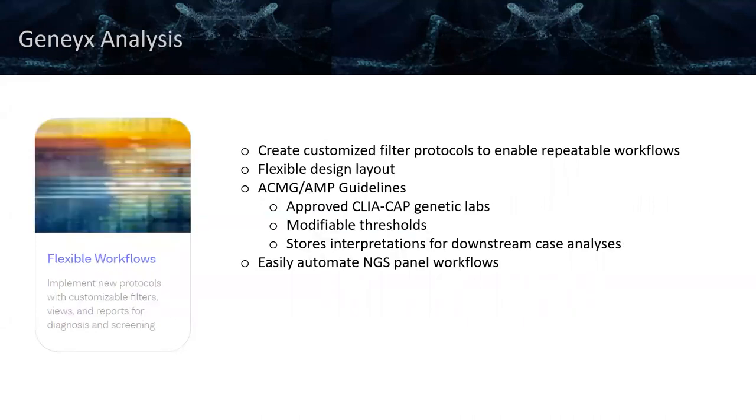In terms of the flexible workflows, one of the things that is of primary importance in the clinical and diagnostic settings is obviously obtaining consistent results. And the way that you do that is by utilizing filter protocols. The filter protocols within the Geneyx Analysis platform are entirely customizable, and what they allow you to do is obtain those repeatable workflows. Furthermore, the Geneyx Analysis software offers a flexible design layout. So if there's a particular feature that you want to have displayed when you open up the application, you have the ability to create that modification.